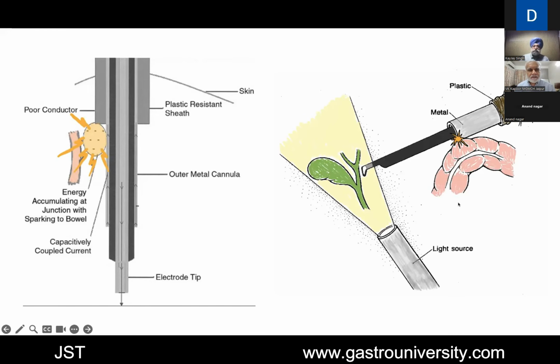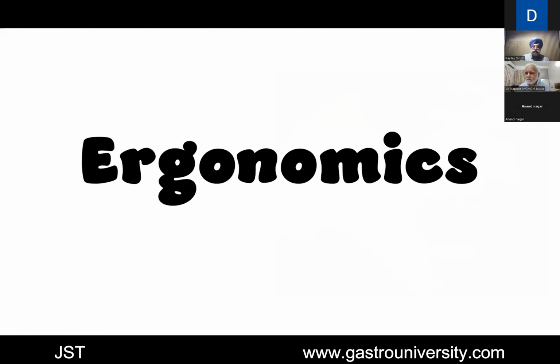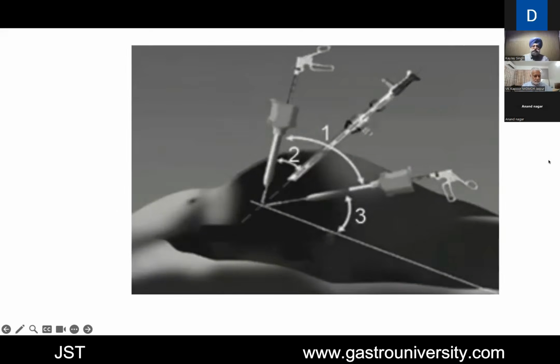Only 2-3 more minutes. I'll have to really skip. Ergonomics, again, is very important because we are discussing ports and instruments. Ergonomics are very important because of the comfort. For the surgeon, the surgical fatigue is less, and more important, the ease of dissection and the display of structures and anatomy is much better if we honor the principles of ergonomics.